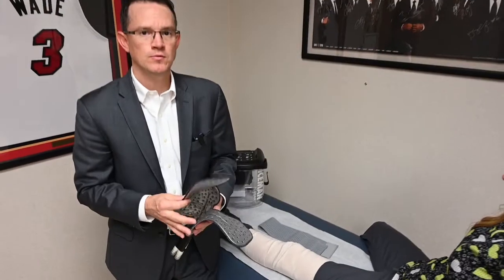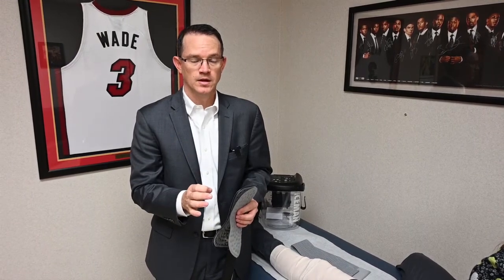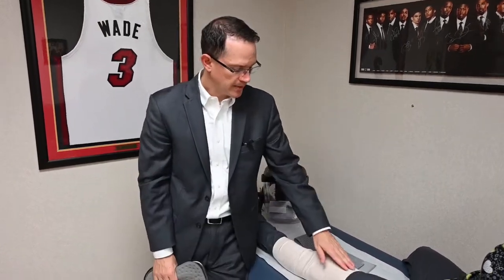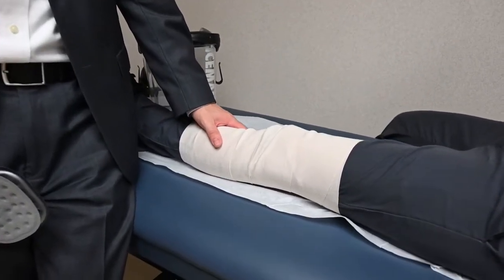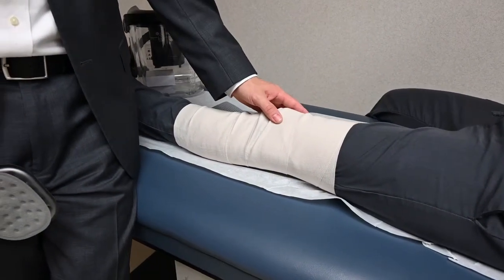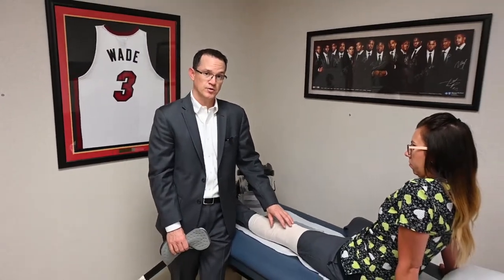It is important with the polar care that you are careful to never put the polar care directly on your skin. Because of this, we will wrap an ace wrap around the knee for a number of different reasons. We will do it to hold your post-operative dressings in place, and we will also do it to give the knee some compression in order to prevent post-operative swelling.